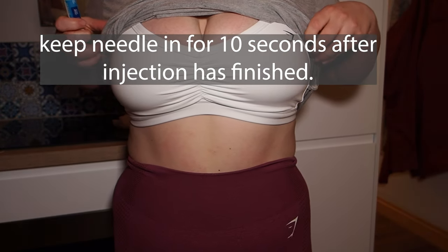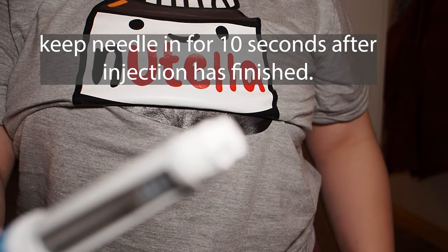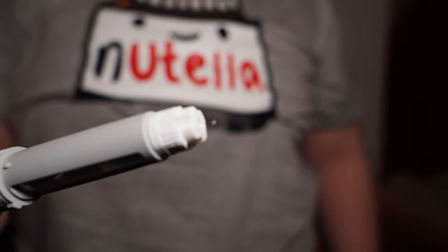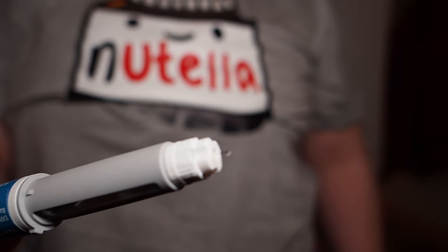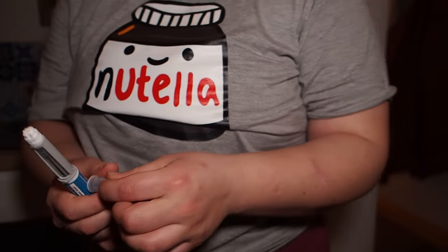Then just take it out. You might have a little bit of bleeding or a little bit of the medication around your tummy — that's completely fine. Cover yourself back up or just remain naked. You might also get a bleb at the end of the needle and that is completely fine. You don't need to put it back in or press anymore.